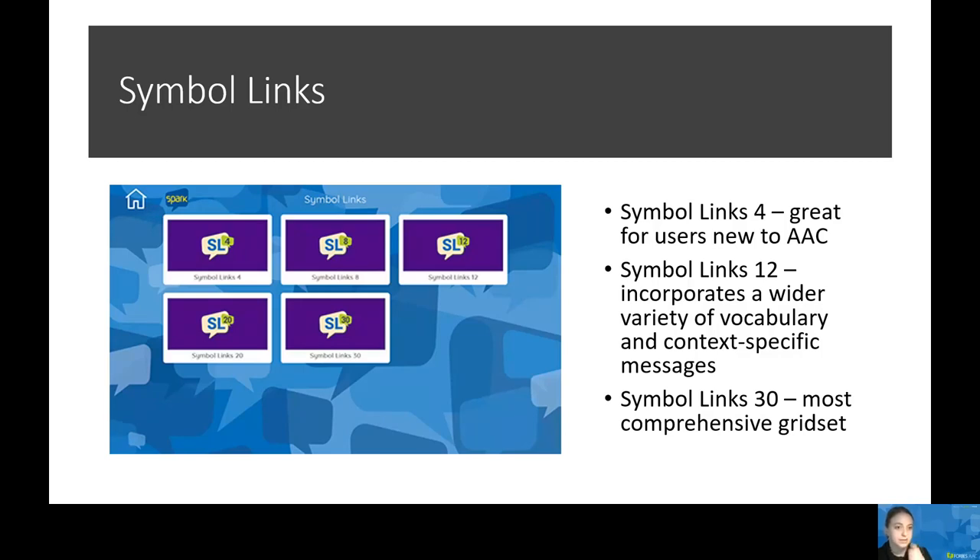Finally, we have Symbol Links 30. This is the most comprehensive grid set in the Symbol Links series. Topics include community outings and hobbies. It has categorically organized vocabulary to support a wide range of expressing different wants and needs, as well as essential quick fire phrases that help maximize the speed of communication in social contexts.